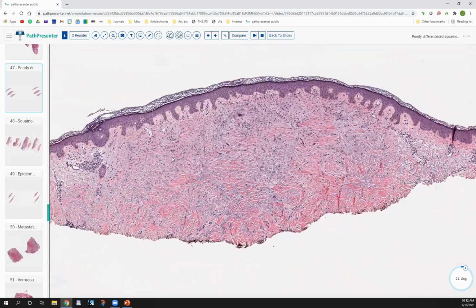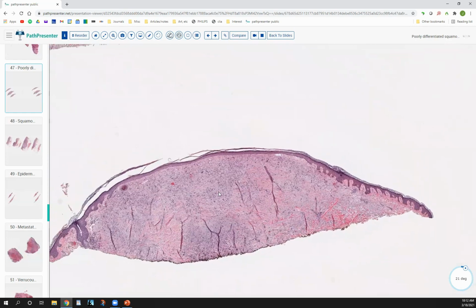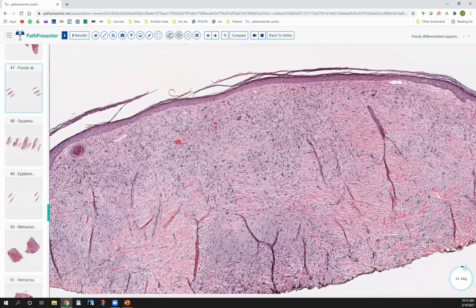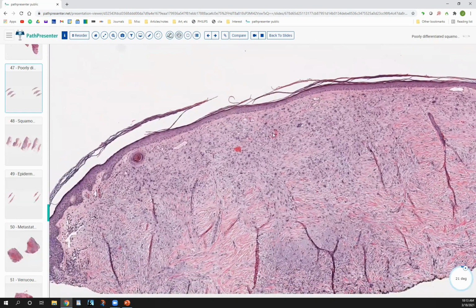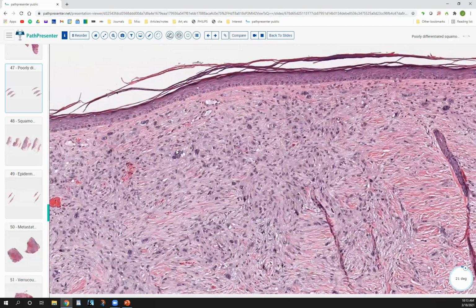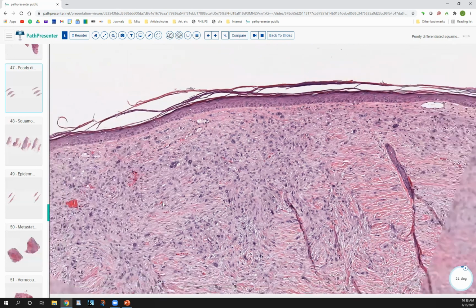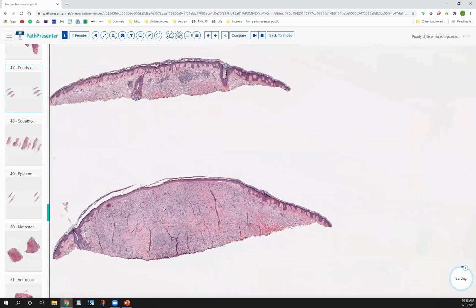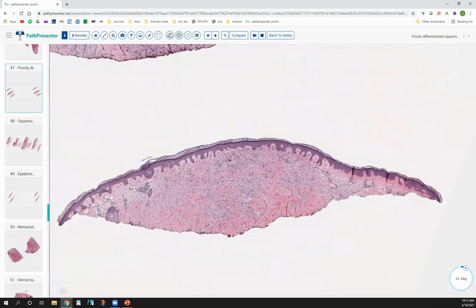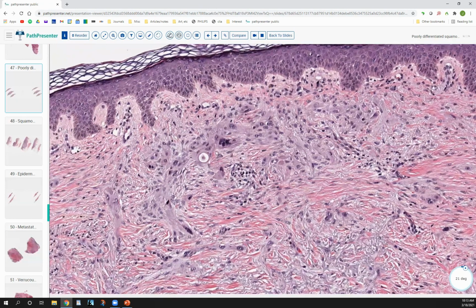We typically use cytokeratin 5/6. Some people use P63, P40. We've had our best experience with cytokeratin 5/6. But really not much connection to the epidermis. So it's a fairly tricky one to identify, really ugly cells, which make me really think about atypical fibroxanthoma. But in this case, I'm sure the immunohistochemical studies were done and showed that this was a poorly differentiated squamous cell carcinoma. There's pleomorphism if you ever saw one.